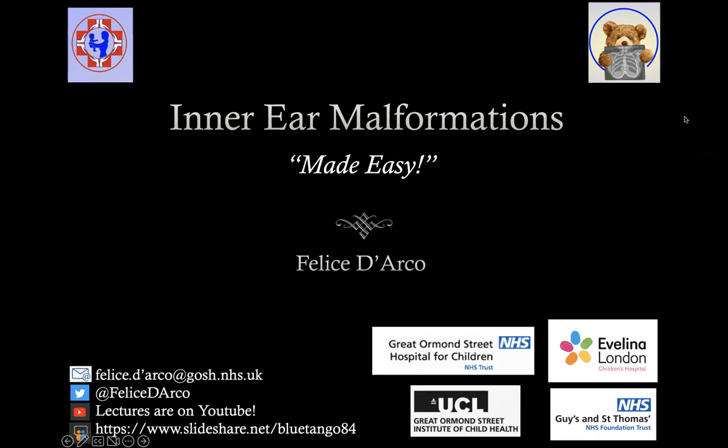This is a brief talk on inner ear malformation made easy. What I would like to do is to start from the anatomy and then show you some easy patterns that can be easily recognized on radiological images, but they can have an impact on your patient's management. So you can do fantastic diagnosis just by recognizing some specific patterns.